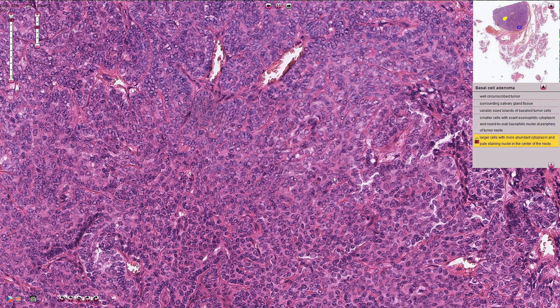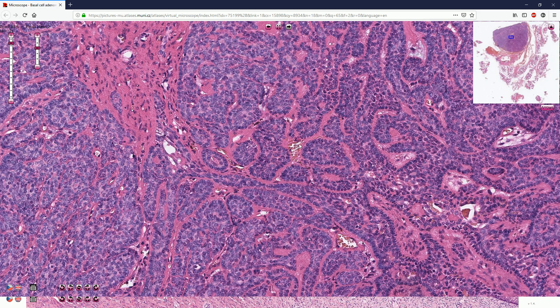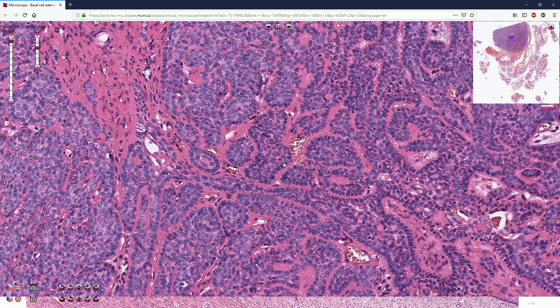In this part we can see the solid pattern of growth, and here we have an area which more resembles the membranous pattern, which is composed of multiple solid nests that fit together as a jigsaw puzzle, and around these nests we can see hyaline hypereosinophilic material.